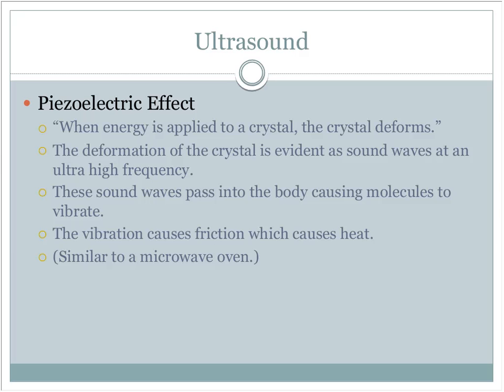But this is why it's really important that we don't drop the sound head. And if it does happen, we should probably have it checked. When patients sometimes feel a buzzing or any kind of electrical discharge, almost like static electricity coming out of it, you probably need to call the person who calibrates the equipment and let him know specifically what's going on, because he'll just come in and check it like they normally do and say it checks out fine, but he may need to be checking more.